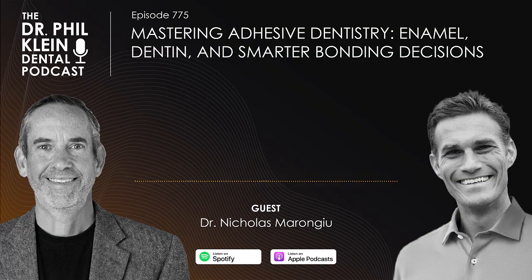All of our curing lights are charged overnight every night, and in our opening protocol, the assistants check the output of our curing lights every single day to make sure that the curing lights are at optimal energy. It's very easy to do. Most curing lights have that on their cure base. We also use a Solventum curing light along with the Solventum resin. Again, not mixing and matching manufacturers, to make sure that everything is as ideal as can be. So check the energy on your lights, make sure the output's appropriate, make sure that it's aligned with the resins that you're trying to cure.